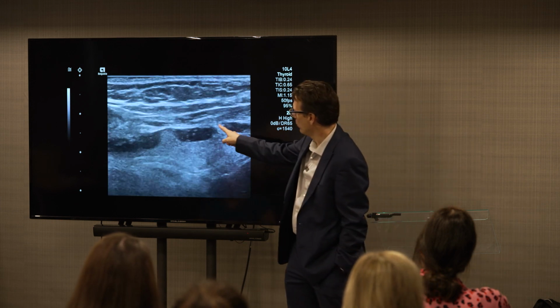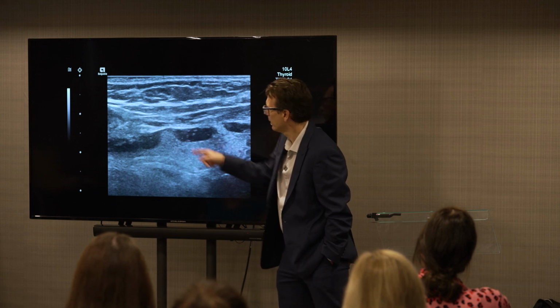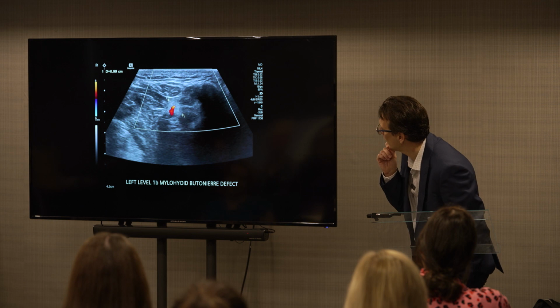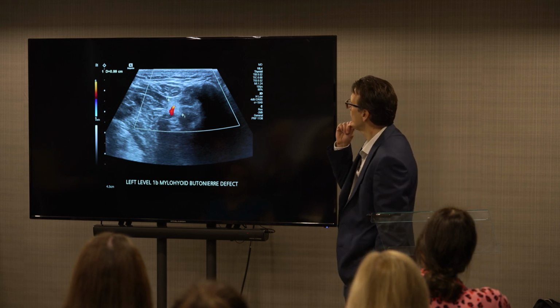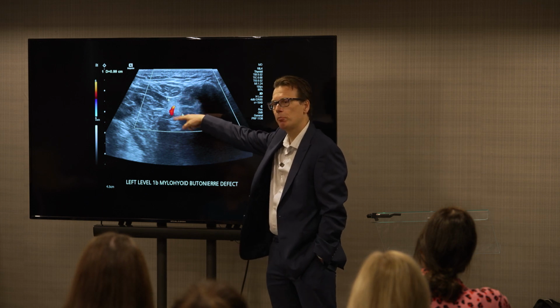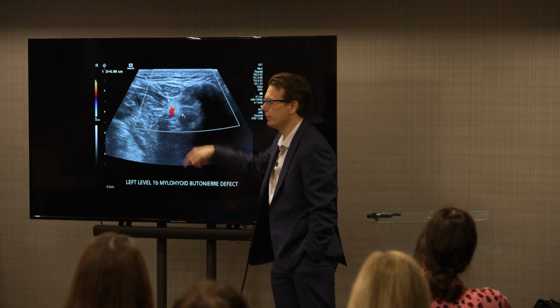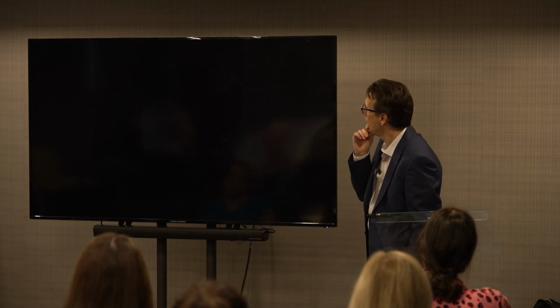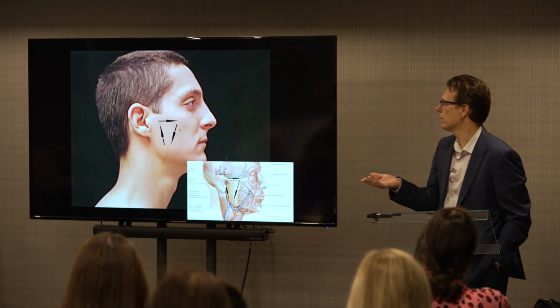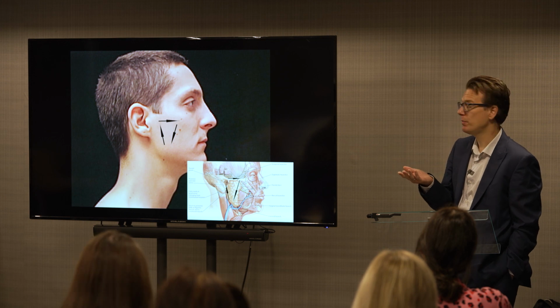And again, you can get smaller ones. Okay. Next slide. Okay. And if you're not sure, you can always put colour Doppler on it, and you can see some. Okay. Once finished interrogating the submandibular region, move on to the parotid region.